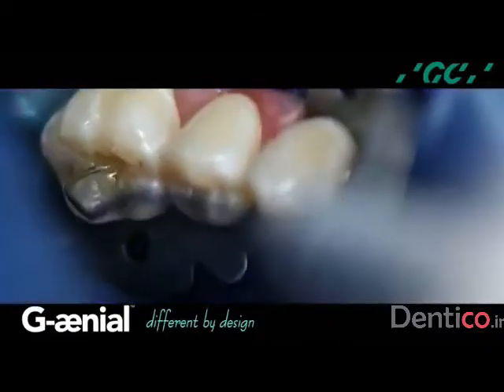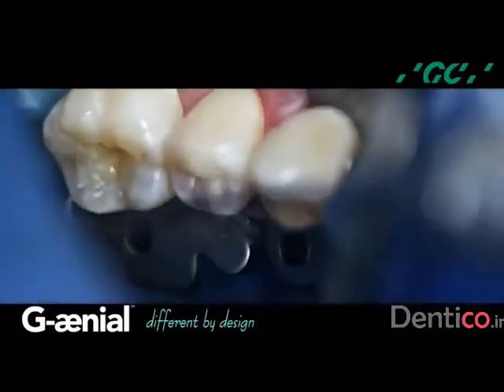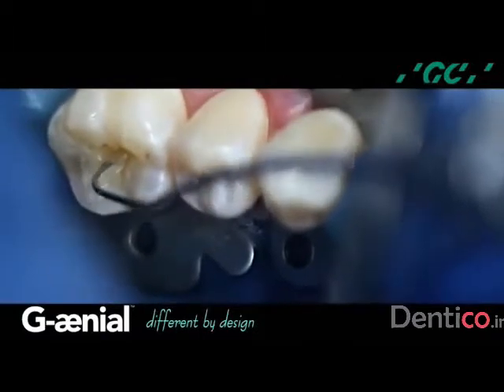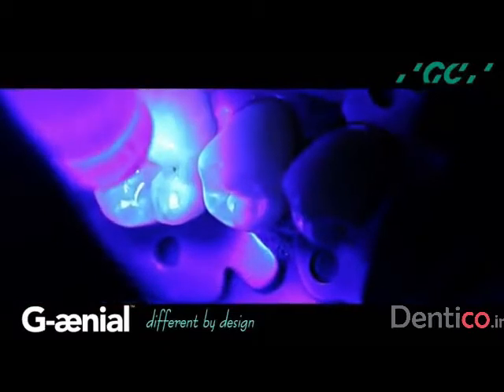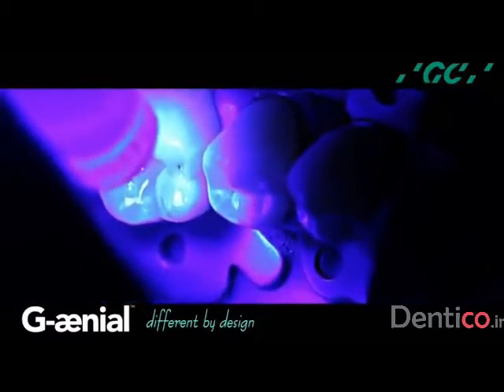I now use an A2 shaded Genial Universal Flow and the successive cusp buildup technique with an 11/12 Explorer tip and light cure for 10 seconds.